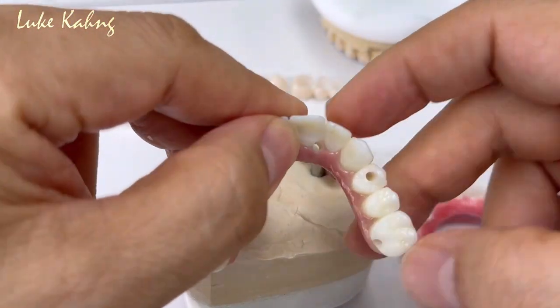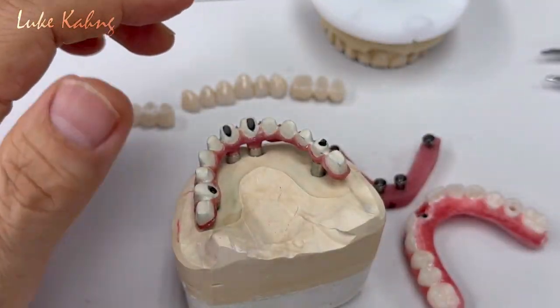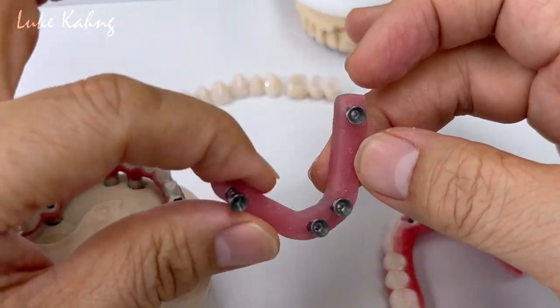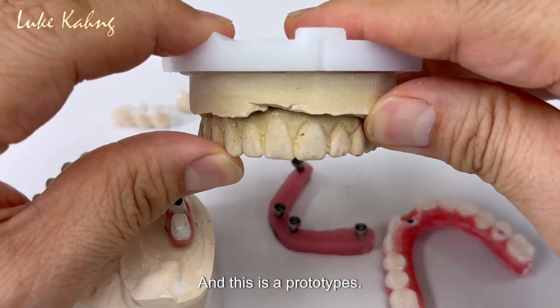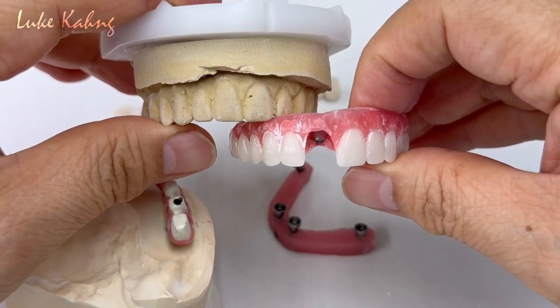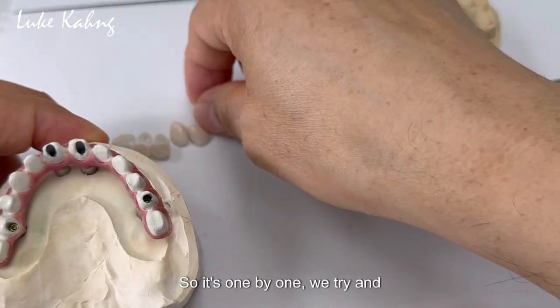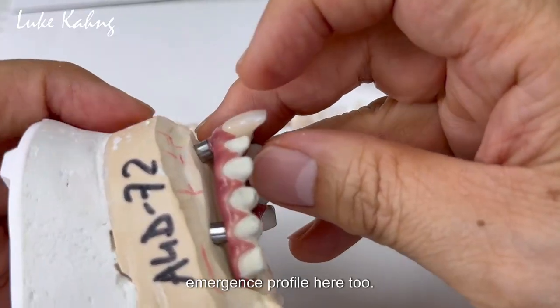For example, this case — not the same case, but from the verification jig after impression. This is a four-implant type. There are humongous differences, and this is a prototype with a good wax try-in and setup. It's made with all individual-looking restorations, just like individual teeth, so it's one by one. We try and make the exceptional emergence profile here too.